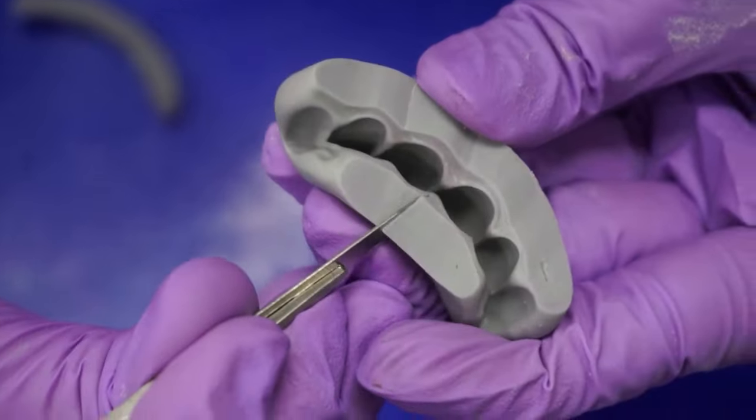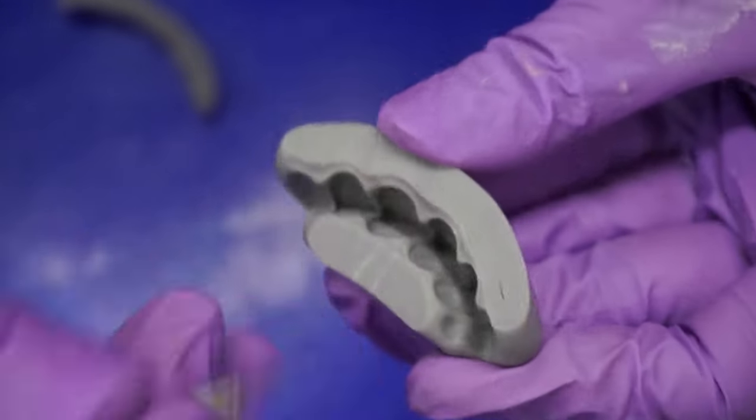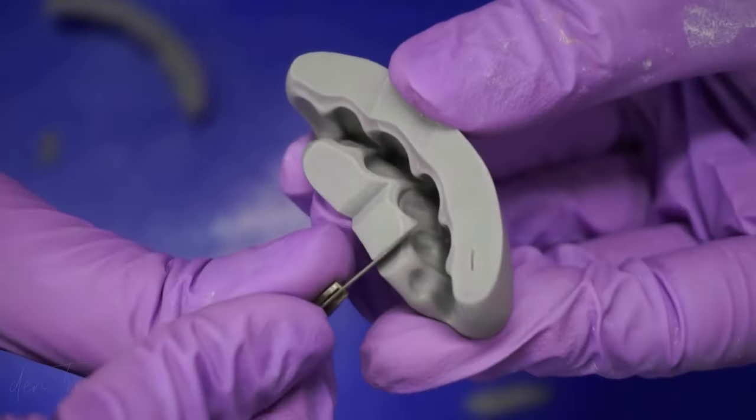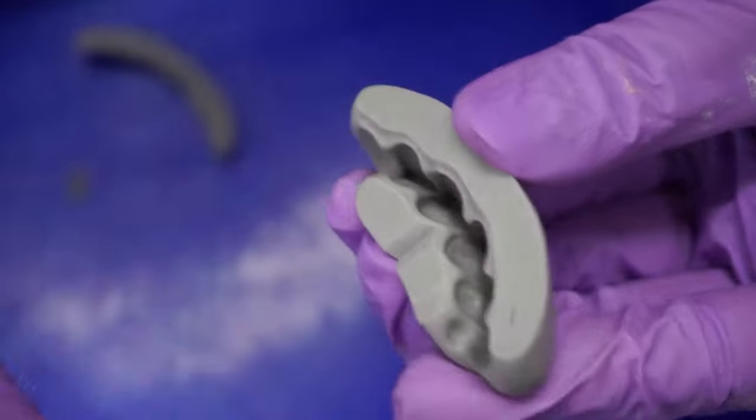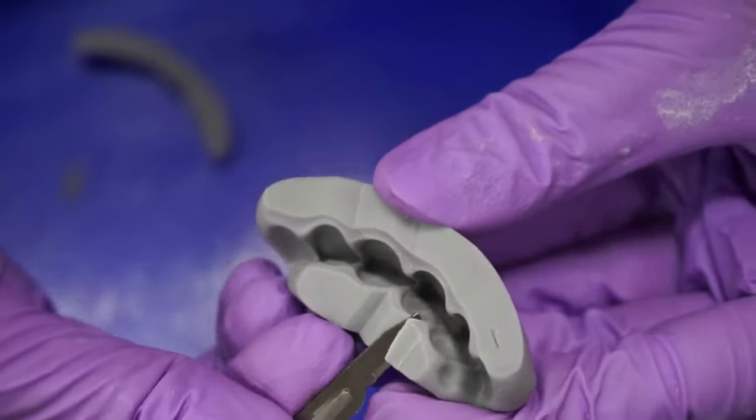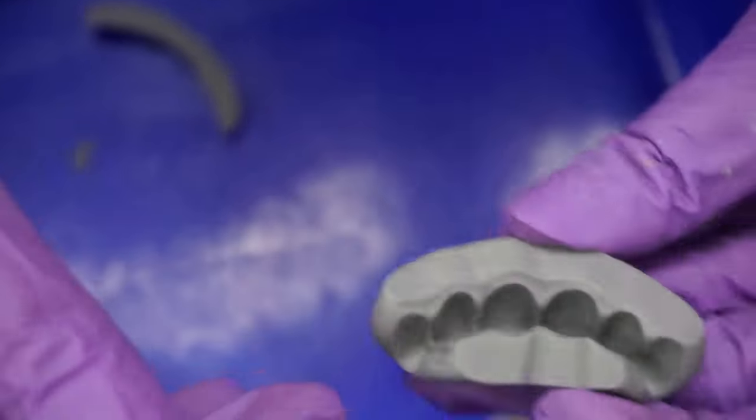Also, it is important to create notches on the index at the gingival embrasure region so that all the excess temporization material pools in that region making it super easy to remove.